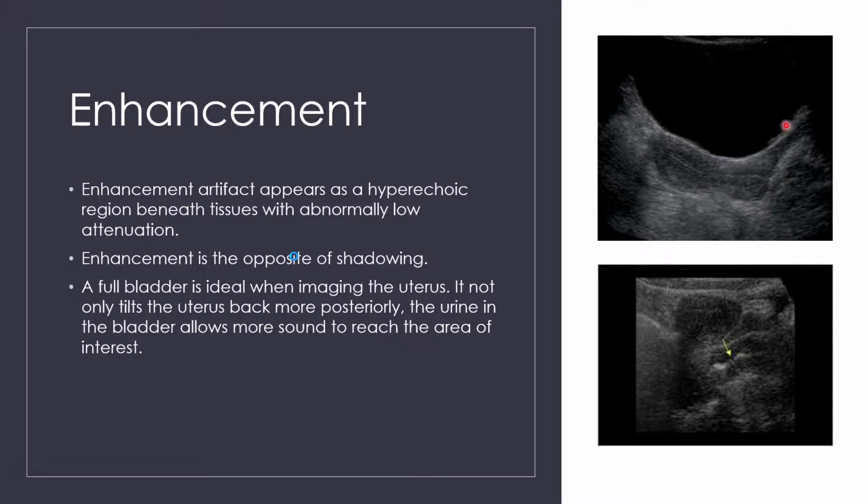So this is a patient with a full bladder. Now I will say at pregnancy test centers, you're usually not going to get a patient with a full bladder unless they have been scheduled to come back for their ultrasound. That is because usually they're taking a urine pregnancy test before they're coming to you. So very rarely will you see one that is just perfectly full like this. But this is a patient with an empty bladder.